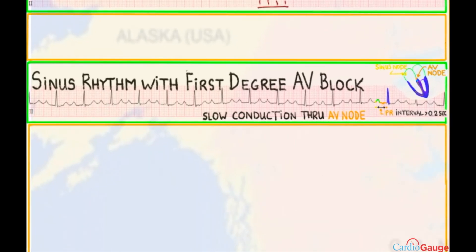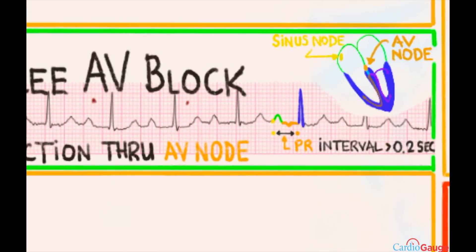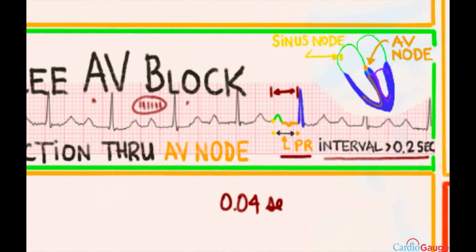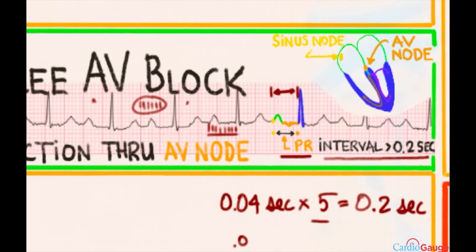Let's talk about sinus rhythm with first degree AV block. First degree AV block is when conduction is slowed through the AV node and the PR interval is longer than normal. The PR interval goes from the very start of the P wave to the very start of the QRS. If this interval is more than 0.2 seconds — equal to five little boxes, since each little box is 0.04 seconds — that's first degree AV block. In this case, counting approximately seven little boxes: 0.04 times seven equals 0.28 seconds, confirming first degree AV block.